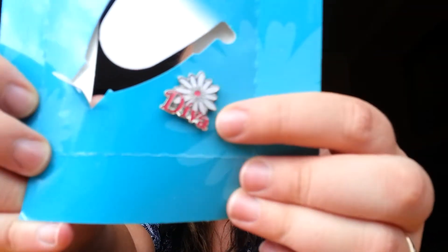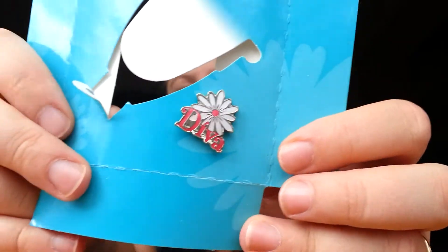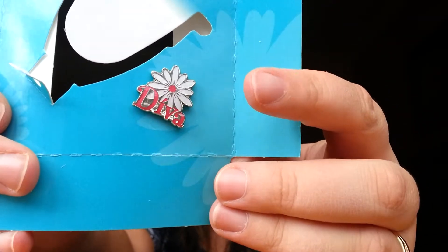I've already used it, so here is what comes inside. Of course there are detailed instructions — how to use it, how long, frequently asked questions, how to insert it, all that kind of stuff. It also came with this little pin that has a flower and says 'Diva' — it's kind of cute, you can pin it somewhere if you'd like.